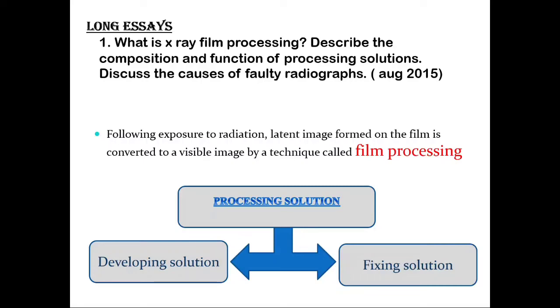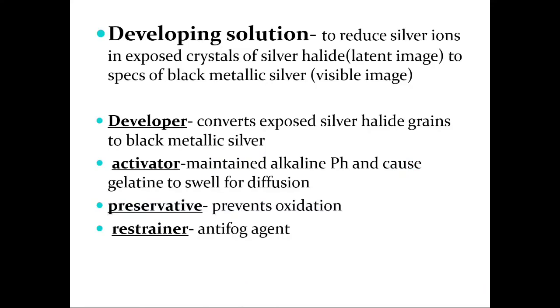It has already been given in the textbook of oral radiology by White and Pharoah, where they have explained it under the chapter of film imaging. Under that they have spoken about the components and functions of each solution, so you can describe in detail. So here I've just mentioned the contents of the developing solution.